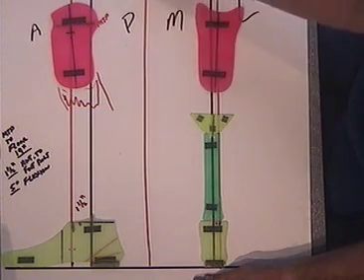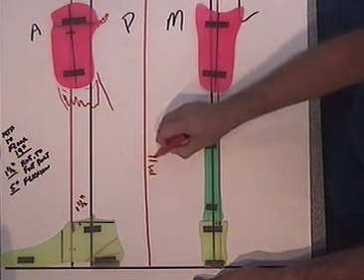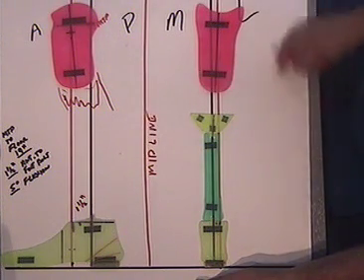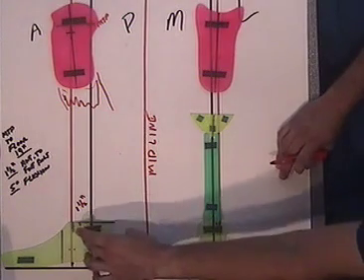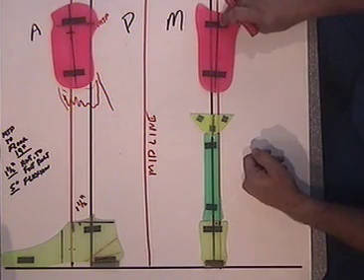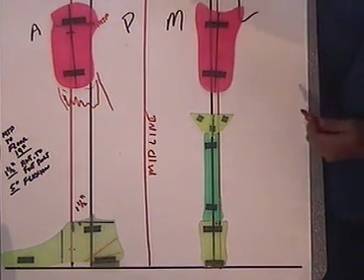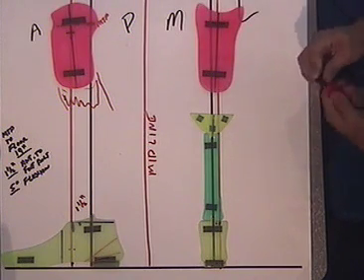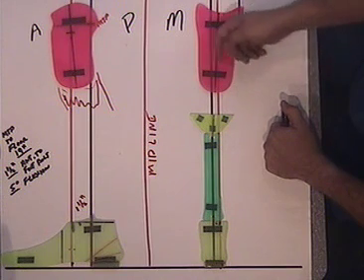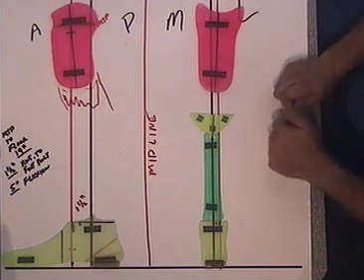So if this was the middle of the body, this would be the midline right here. And this would be the lateral side over here. So the other foot would be over here, and this foot would be here. And this is 1/2 inch outset, set the correct height. And that's really all there is to the frontal plane. It's a fairly easy one to set, as long as you get your 5 degrees of adduction and your 1/2 inch of outset to the socket.